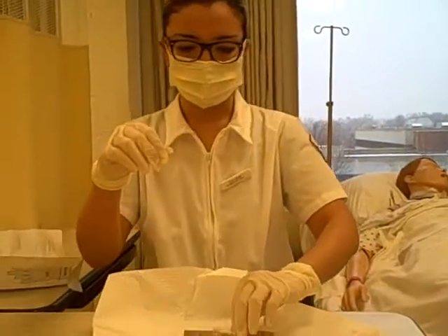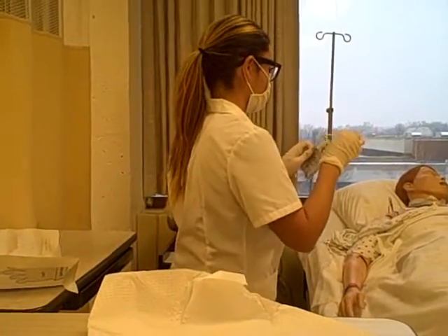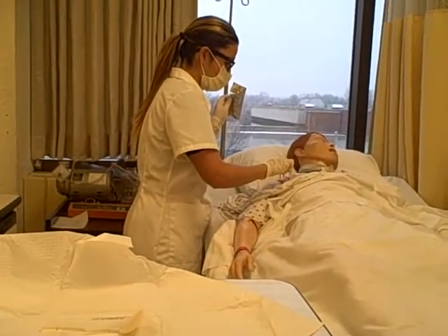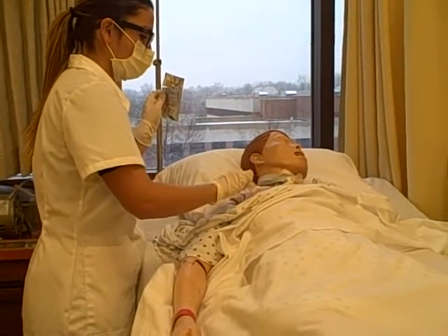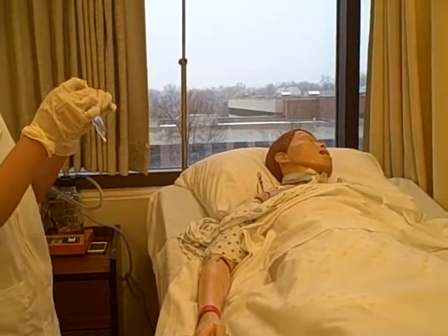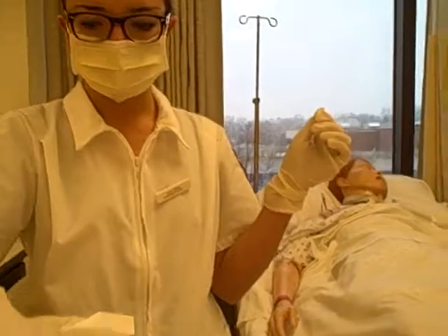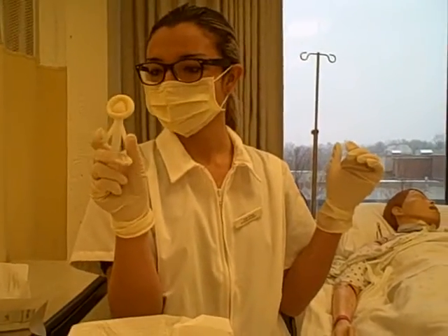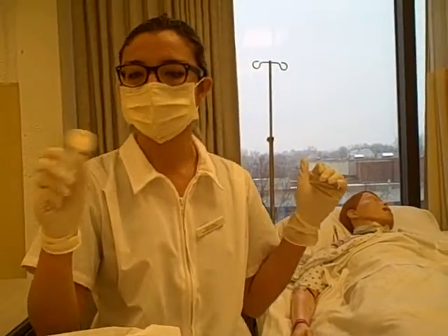And at this point, I'm going to take my alcohol swabs, and I'm going to clean the site all over, and then we can go ahead and get rid of those. At this point, I'm going to grab my antiseptic stick, which looks like this, and I'm going to push in these little sides until I hear a crack, so that means that the antiseptic is coming through our little sponge.